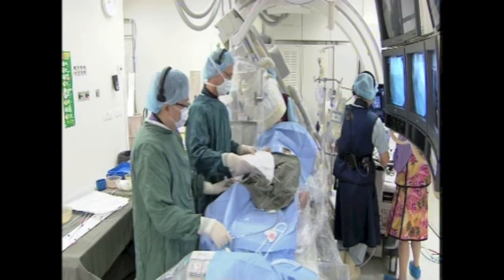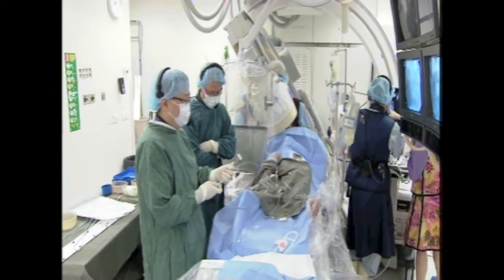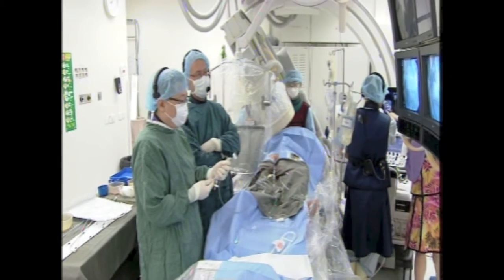Great. How often is this device caught by the pectinate muscle in your experience? It's rare. I would guess maybe 5%.